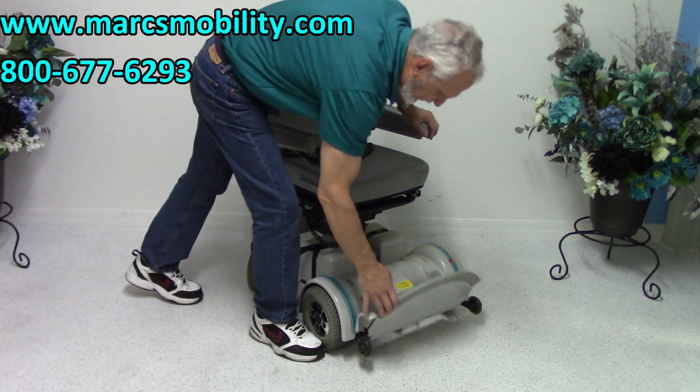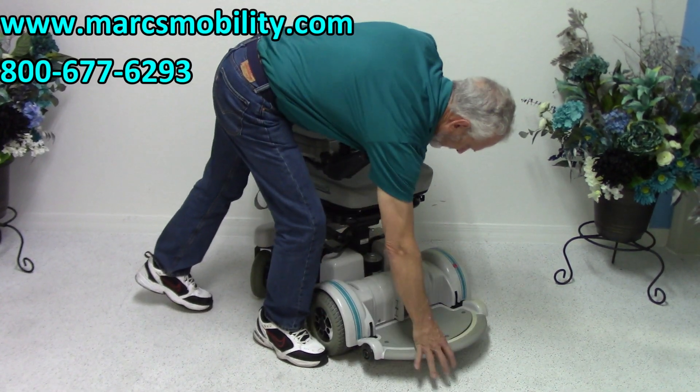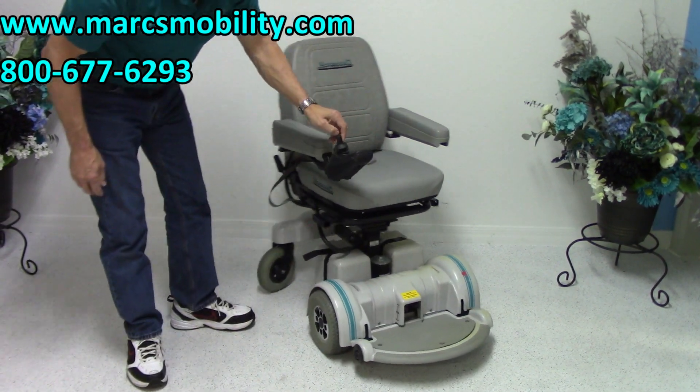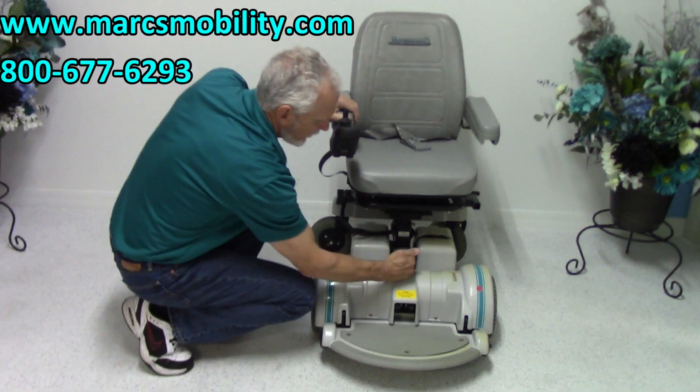This is a rounded footplate, which is nice. You can also lift this footplate when you exit the chair. We do have tip wheels here. There are two motors on this chair — one here and one here; one motor goes this way and one goes that way.